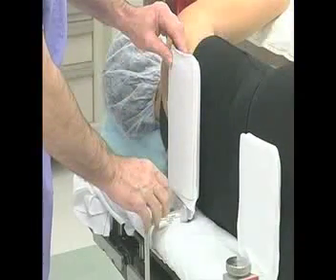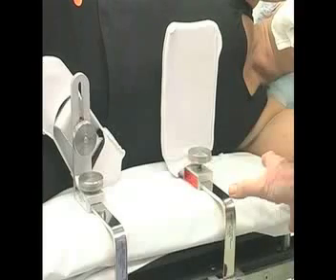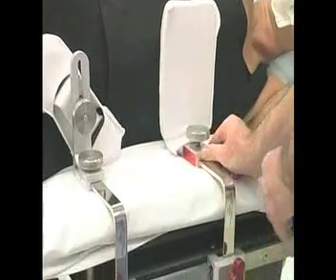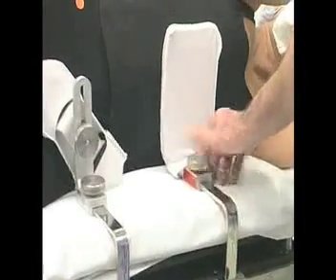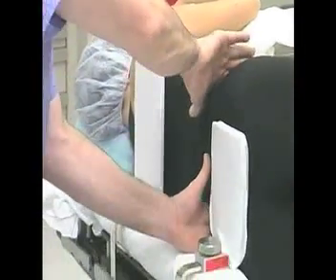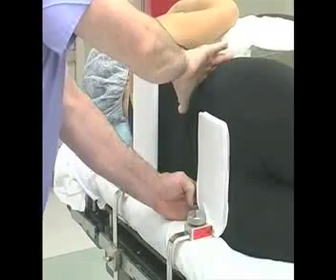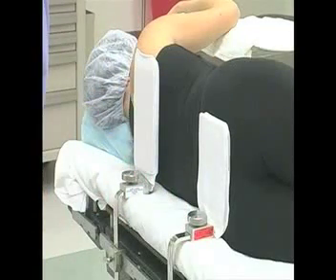Now the final tightening can be performed. Slide the flat posterior pelvis support against the patient by applying firm pressure at the base next to the bar, then tighten the thumb screw with modest force. Check the pelvis for stability. Slide the flat posterior chest support until it is about the same distance on the bar as the posterior pelvis support, then tighten the thumb screw. The flat anterior chest support is slid toward the chest to provide support and prevent the chest from rolling — do not over tighten. The diaphragm remains free to allow easy breathing.